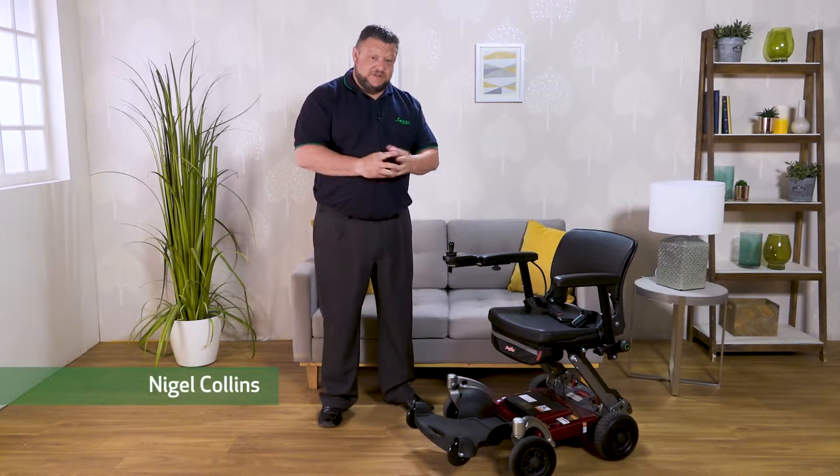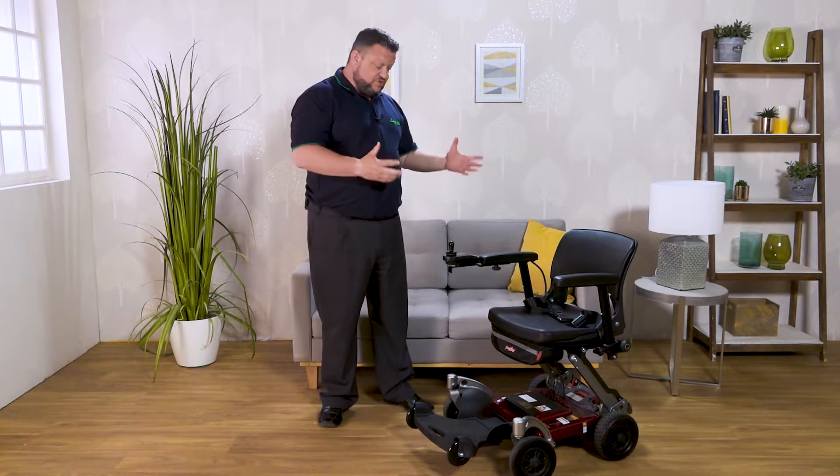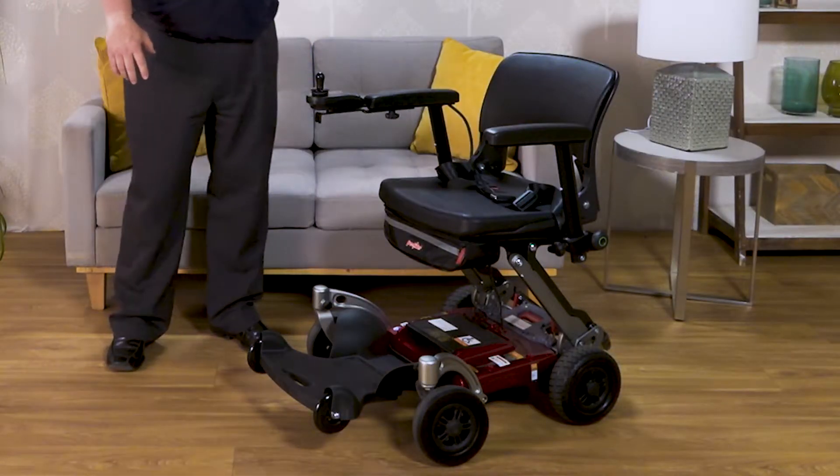Hi, my name is Nigel Collins. I'm part of the Leggy team and I'd like to take this opportunity to show you the Leggy Powerchair and some of its features.